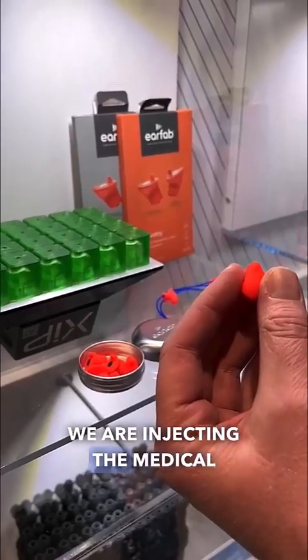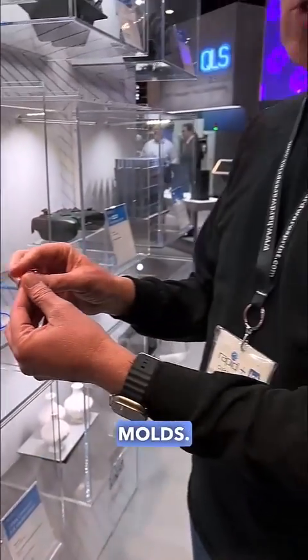We are injecting the medical grade material into the molds. And after that, we are getting them out of the molding tools in, let's say, a proprietary way.